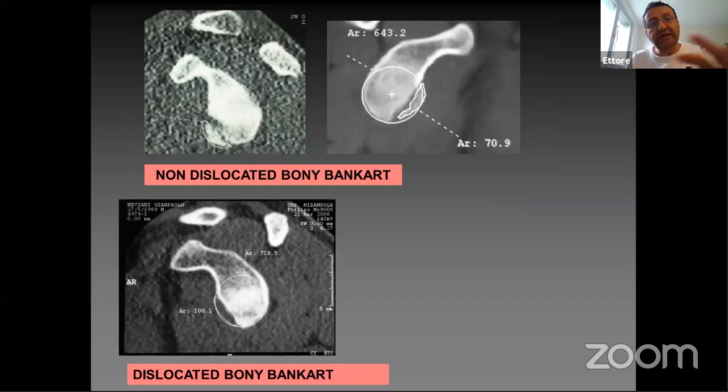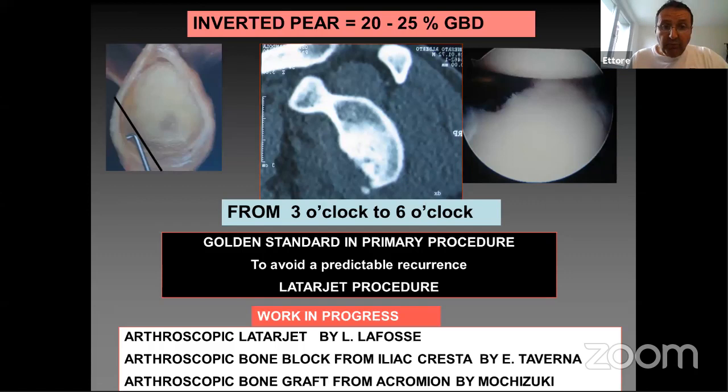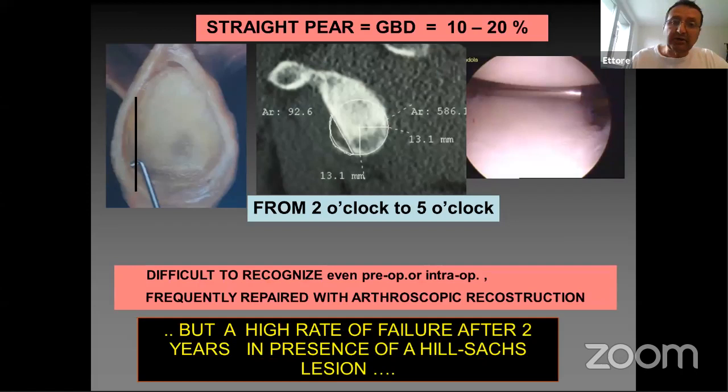So we need to get used to this image of en face glenoid, which is really very helpful, because after you've seen several, you just look at the image and you don't need to calculate if it's 15, 18, 20, 22. You know that when we have a bone loss on the anterior glenoid, it is no more convex here, it's straight or something like this, it's going to be unstable. And so this is my practice. And this is why we see all these patients with the suture anchor repair with a straight glenoid that had recurrence, because even if the procedure was well performed, the indication was wrong. And so we need to know that on these patients, we need to do different techniques. Francesco will talk later about how to fix these patients.